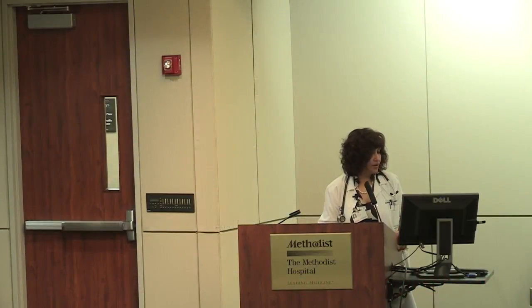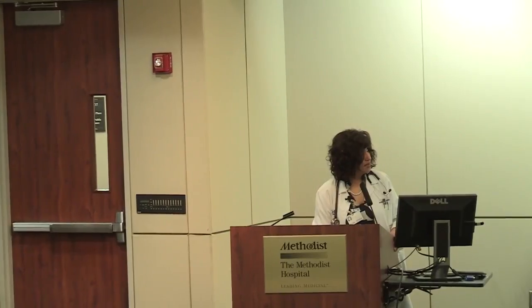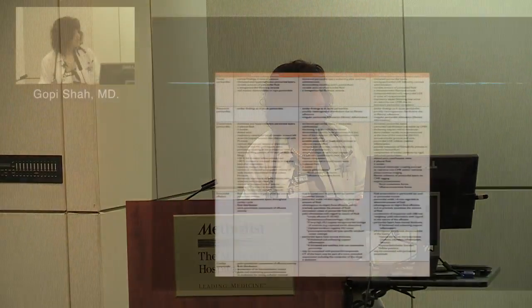Basically, it shows us the different things we look at in different modalities. It's a pretty busy slide, but I will just try to focus on the echo part of it. The advantage of echo over CT and MRI is the portability, the cost effectiveness, and the ability to get a lot of hemodynamic information at bedside, which is sometimes very important. And again, it's very safe for patients because we don't use any contrast agents and there is no radiation.